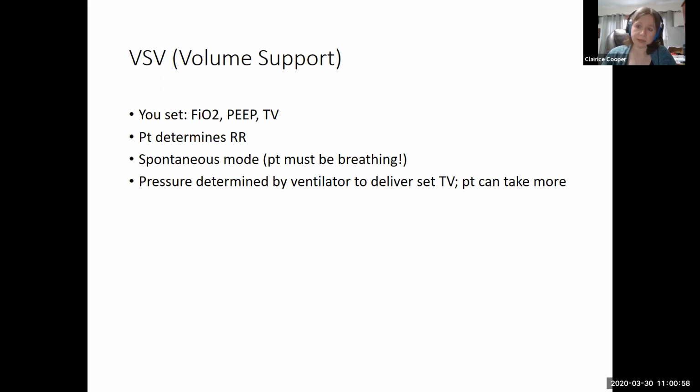For that reason, it's a little less aggressive in terms of weaning than pressure support. With pressure support, you can challenge the patient with minimal pressure and see how they do, and then assess them for extubation. With volume support, you determine an acceptable volume, and then you look at the pressure that it takes for the patient to get to that volume. So you can wean from this mode.